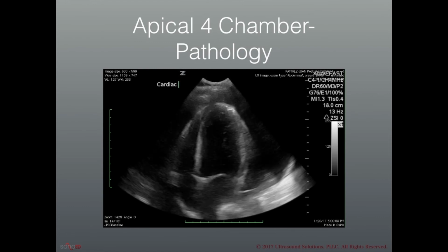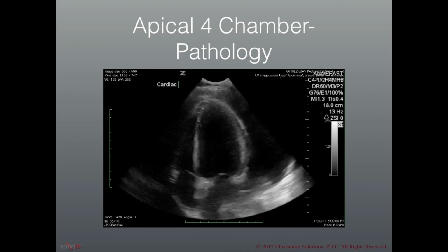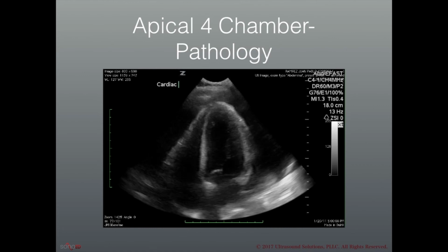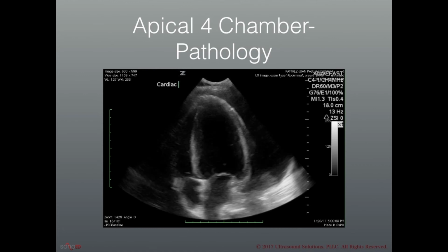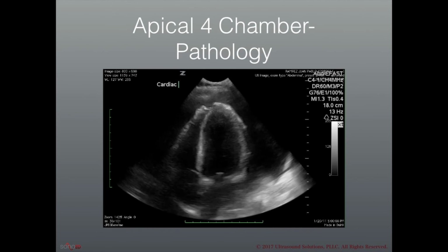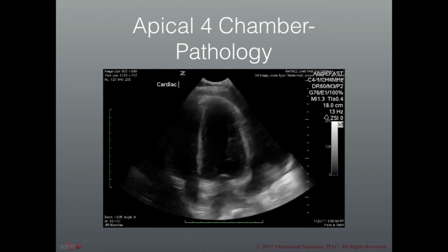The free wall of the right ventricle and right atria seem to be contracting well with systole, opening up and relaxing in diastole without any diastolic collapse. The left ventricle seems to be squeezing well. It doesn't look hypokinetic, and the right ventricle does not appear enlarged or under acute strain.